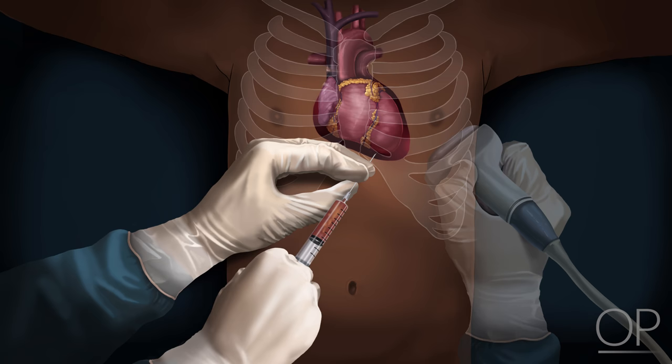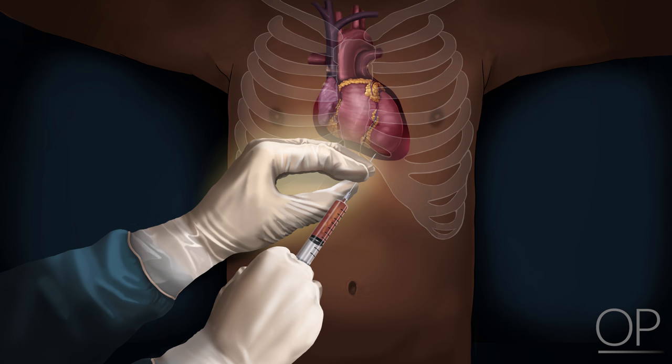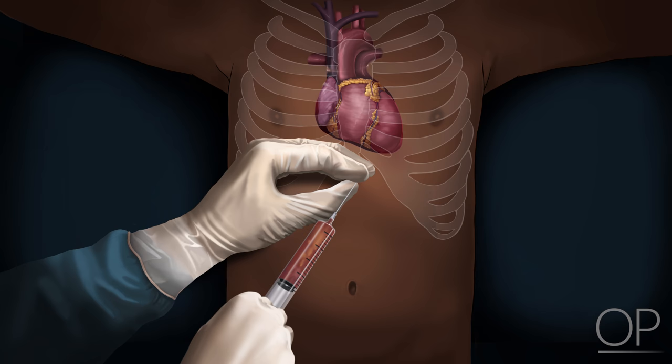If ultrasound is available, confirm the needle is in the pericardial space and not in the heart with an apical four-chamber view. Secure the needle at the skin with your other hand to make sure the needle does not move unnecessarily during the procedure. Change to a larger syringe and continue removing fluid. Remove the needle when you can no longer aspirate fluid and remember to resume cardiopulmonary resuscitation.